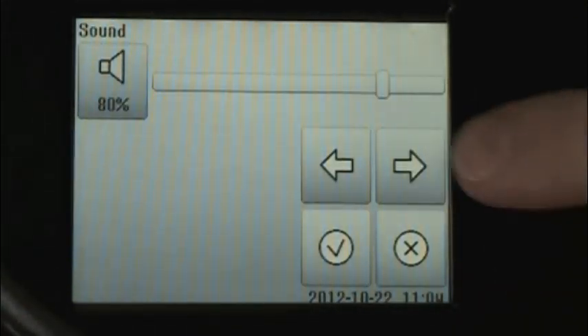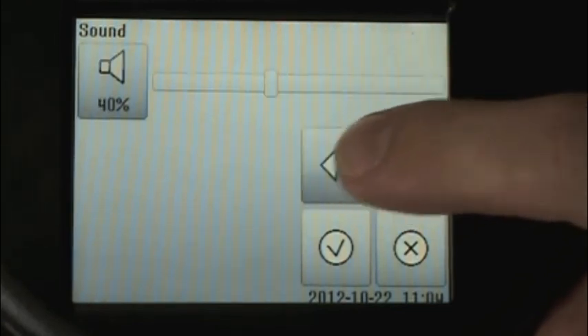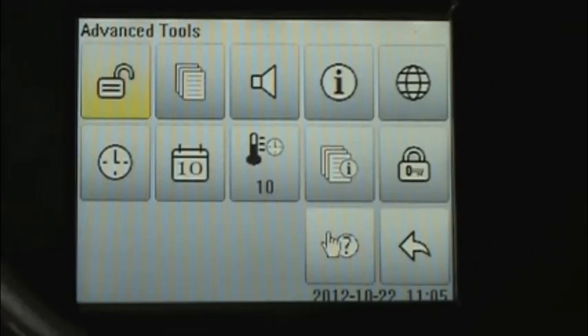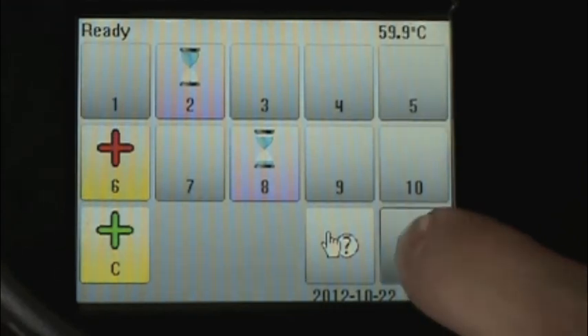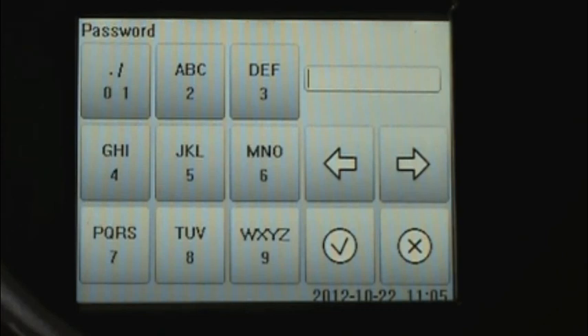Use the left and right arrow buttons to toggle to louder and softer volumes. When we exit from the password-protected settings, the incubator is locked again, and we cannot access these items without again entering our password.